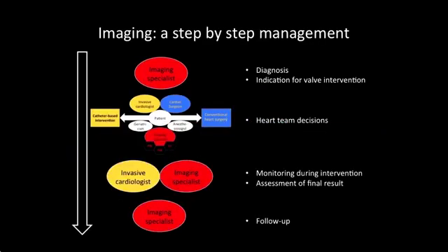However, the role of the imaging specialist is not simply limited to the heart team discussions. Their role is important throughout the patient's management, from the initial diagnosis to the follow-up after the procedure, and includes indication criteria for valve intervention, detailed anatomical description for heart team assessment, monitoring of the procedure, and the final results assessment after valve implantation.